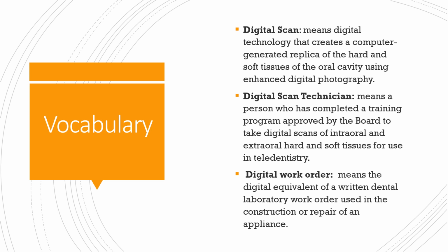Then you have your digital scan technician. This is actually a person who has completed a training program that's approved by the Board of Dentistry to take digital scans of intraoral and extraoral hard and soft tissues for use specifically in teledentistry. You have your digital work order. This is the equivalent of a written dental lab work order that's used in the construction or repair of an appliance. So this is from the doctor.